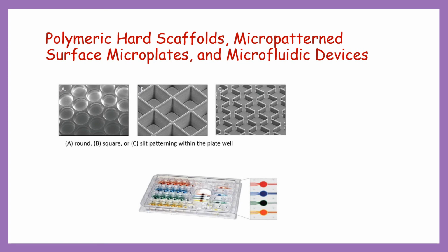On the other hand, microfluidic devices are designed for cell cultures under perfusion and allow for steady supplies of oxygen and nutrients while at the same time removing waste. Microfluidic devices can be built to mimic shear forces found in vivo in cells that are exposed to blood flow, like endothelial cells. A barrier between compartments can be physically incorporated into the device, or it can consist of a non-physical barrier such as a supporting matrix mimicking ECM.